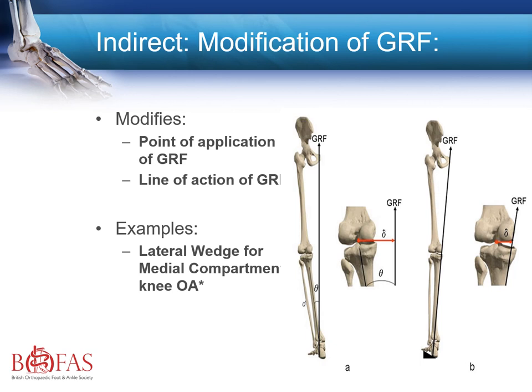And by placing a small triangular orthotic in the shoe, you can see how this realigns the ground reaction force closer to the axis and thereby opening up the medial joint, taking the pressure off the painful area.